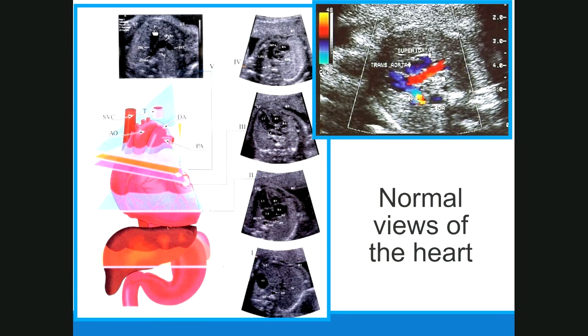We move down just a little bit into this area right through here, where we're seeing the main pulmonary artery coming out of the right side of the heart. And you're seeing this vessel lengthened out, which means you're seeing a cross-section view of the aorta. The pulmonary artery looks like, in this view, it should appear as if it's wrapping around the aorta.